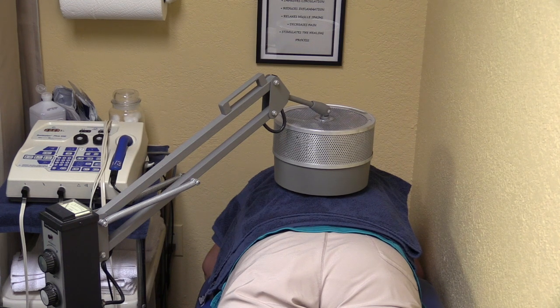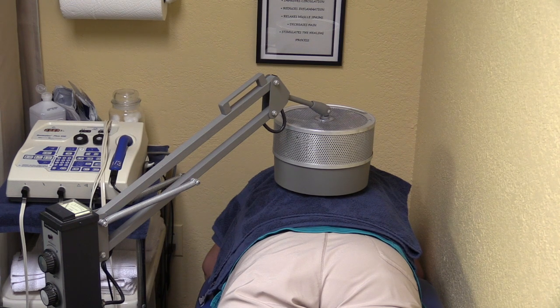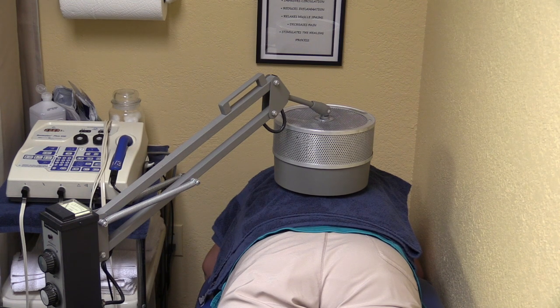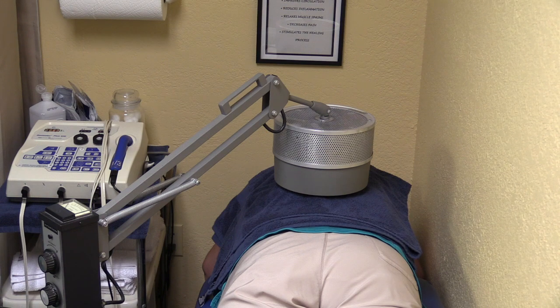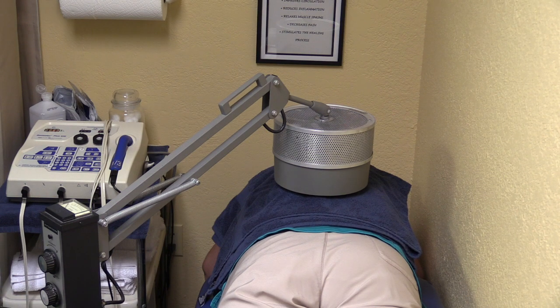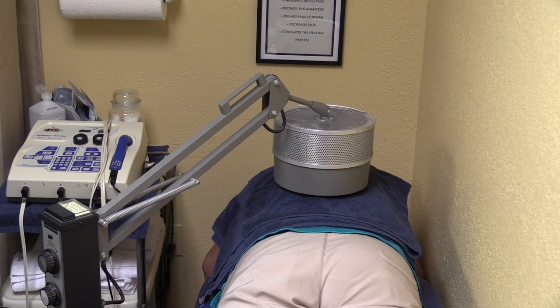It can be used for bursitis, contusions, muscle spasm, frozen shoulder, things like that.